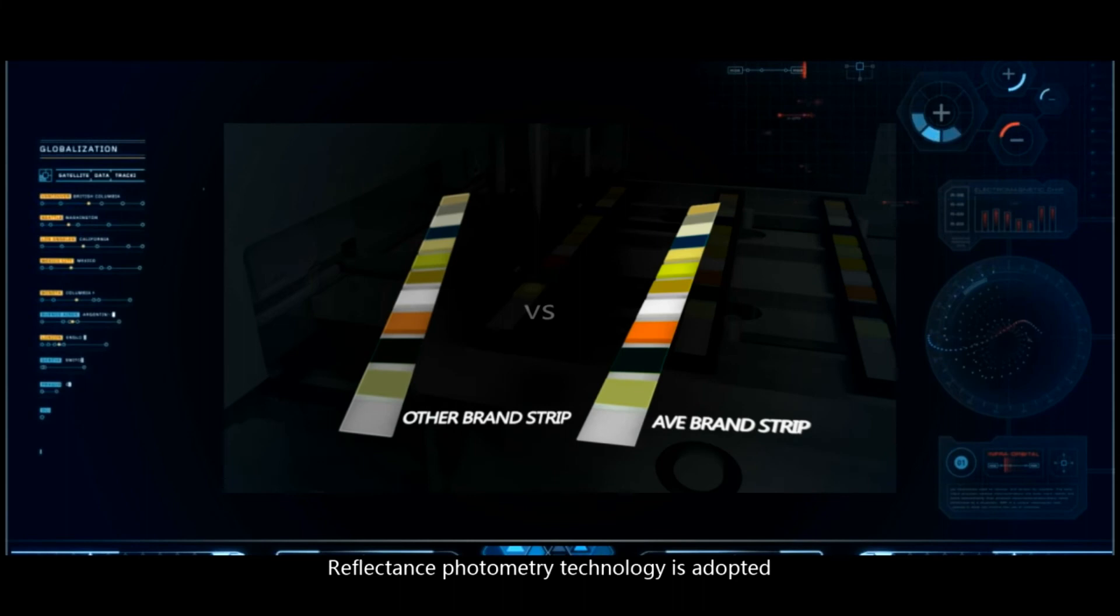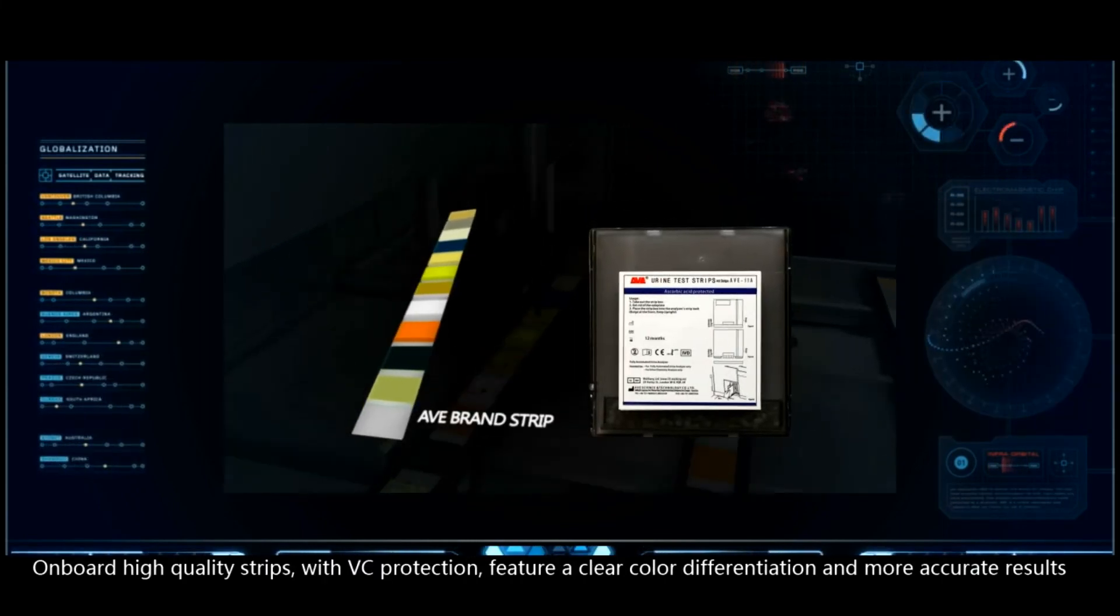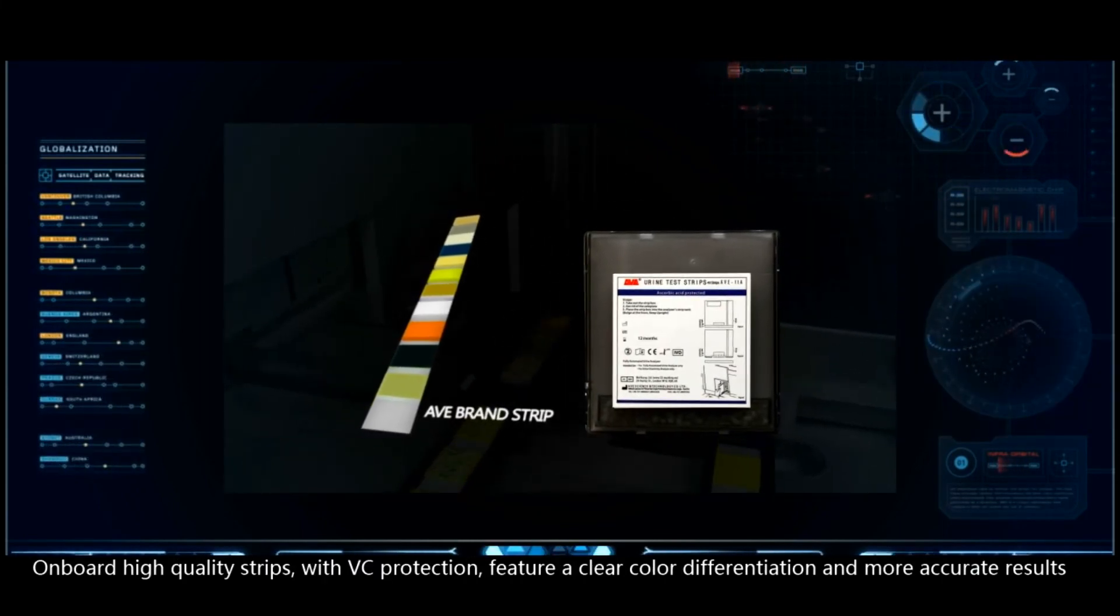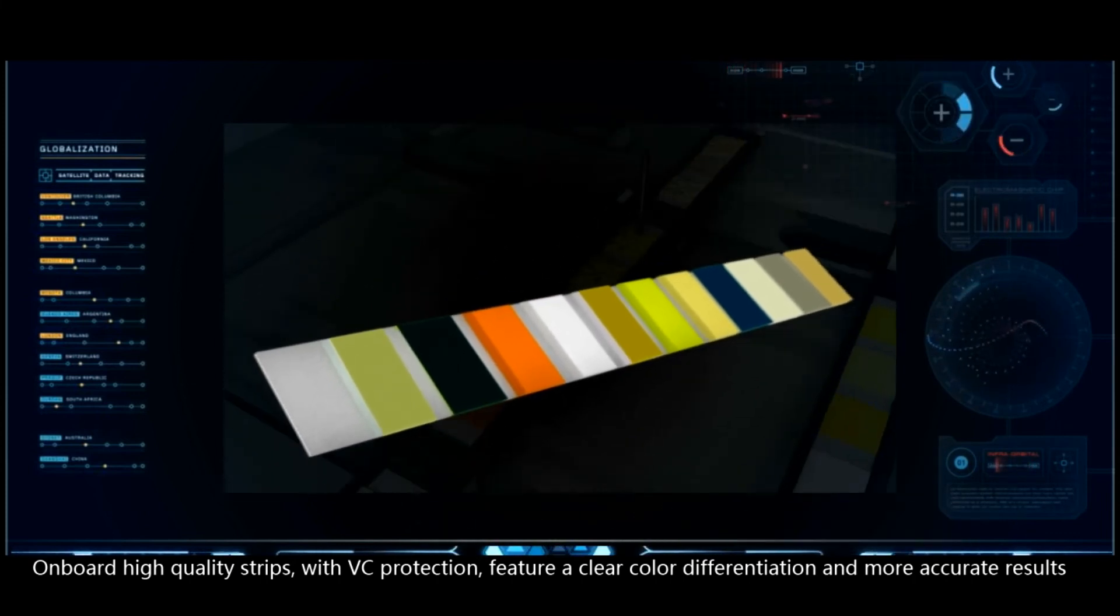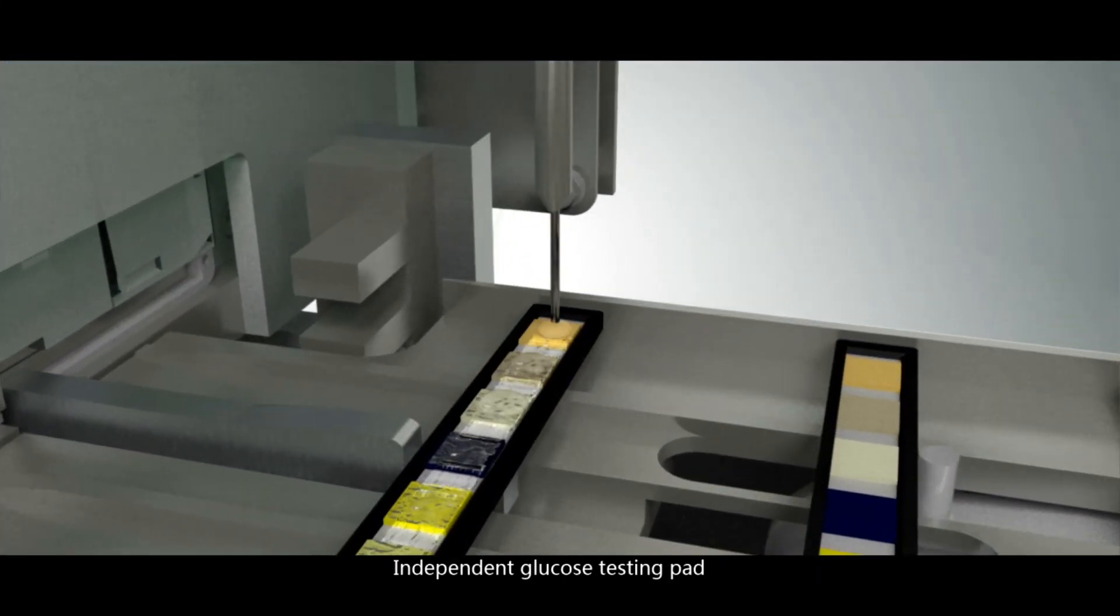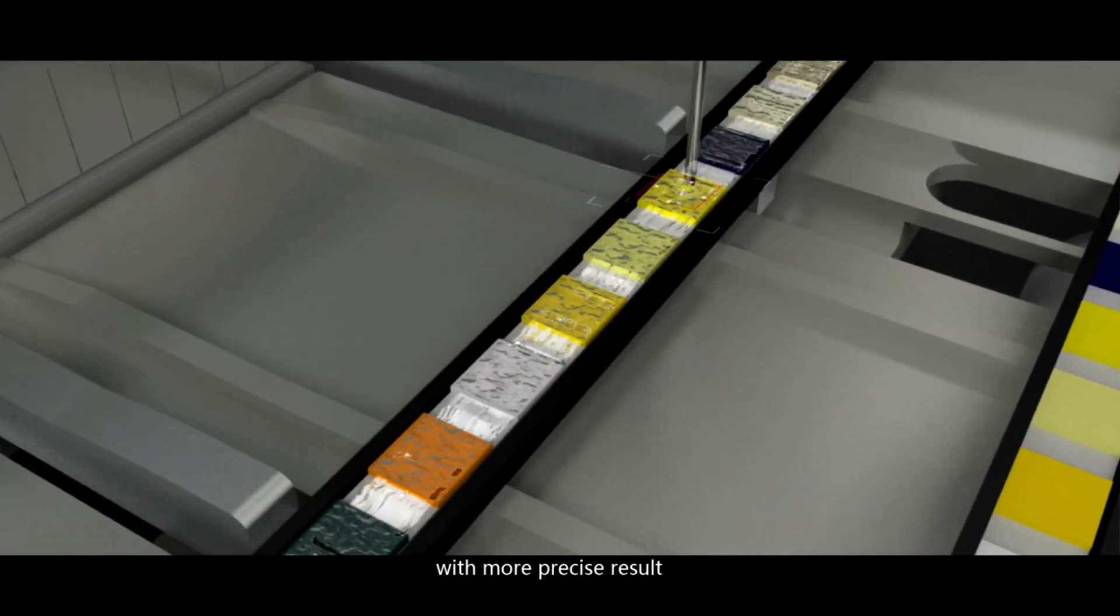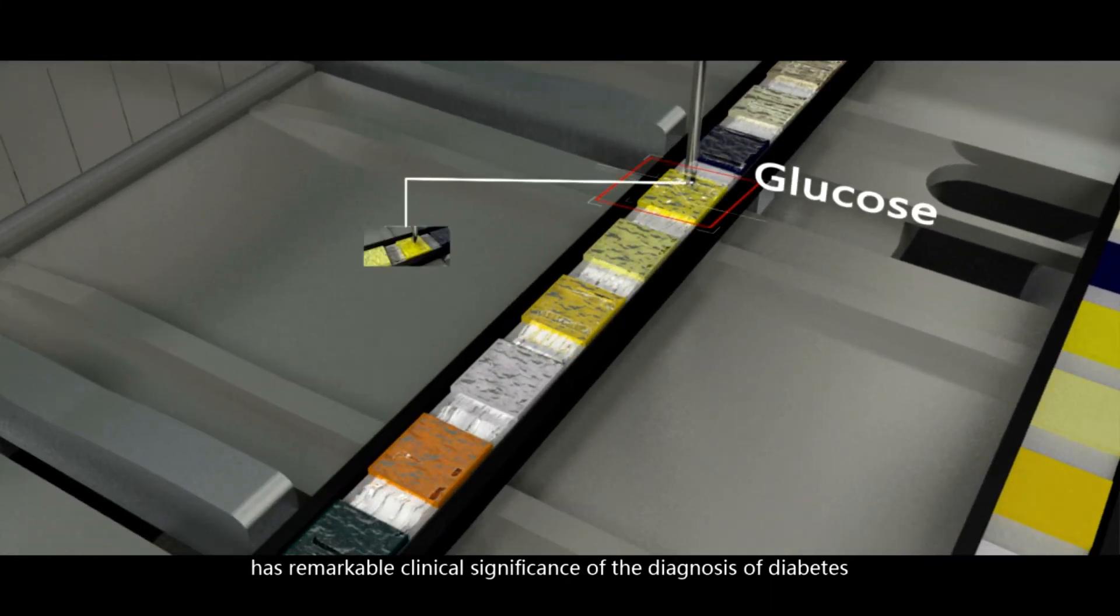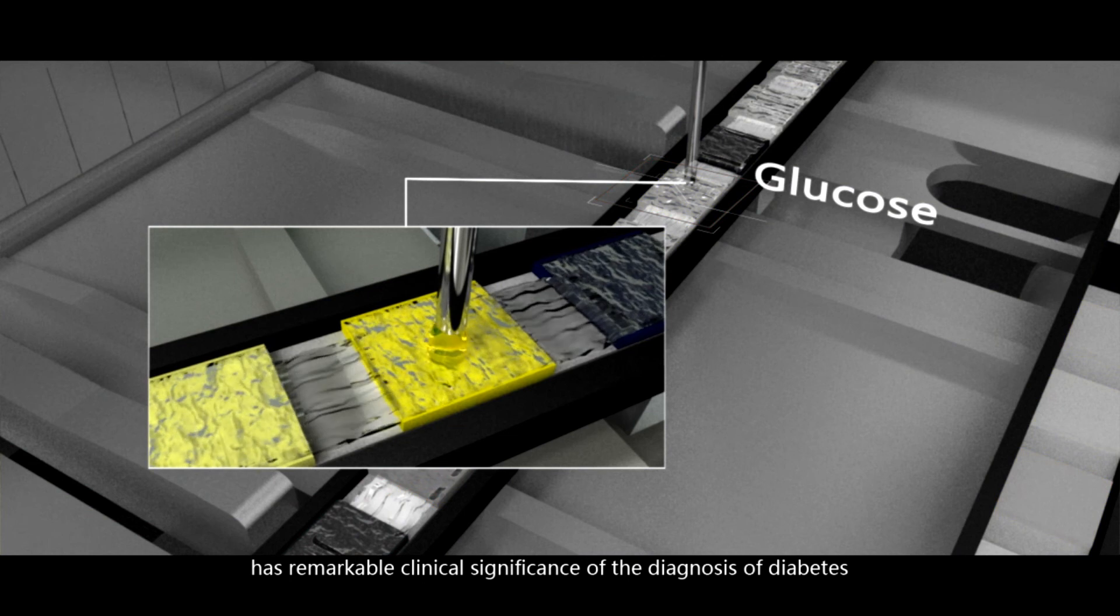Reflectance photometry technology is adopted. On-board high quality strips with VC protection feature a clear color differentiation and more accurate results. Independent glucose testing pattern with more precise result has remarkable clinical significance on the diagnosis of diabetes.